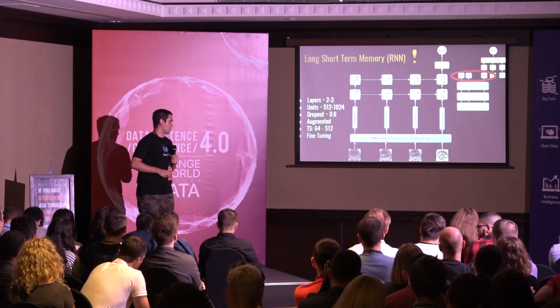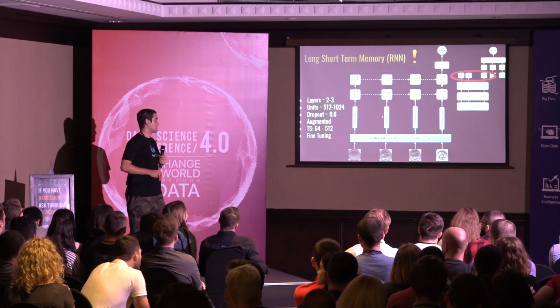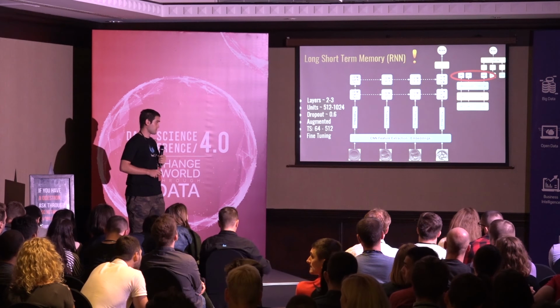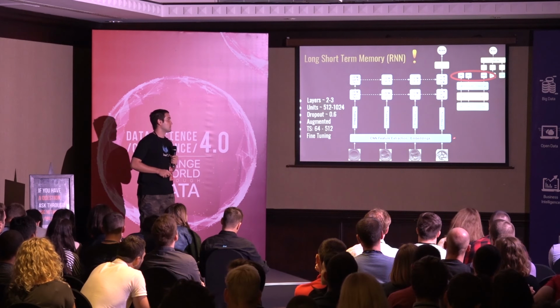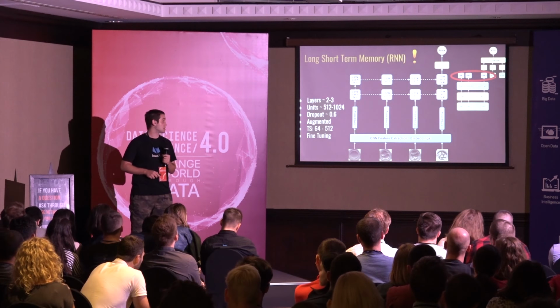Next, frame 2 goes to the feature extractor part. Its feature vector goes to the LSTM network, and so on, until we hit the end, and at the end we get some probability distribution.